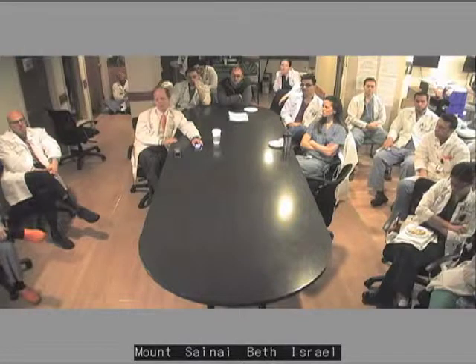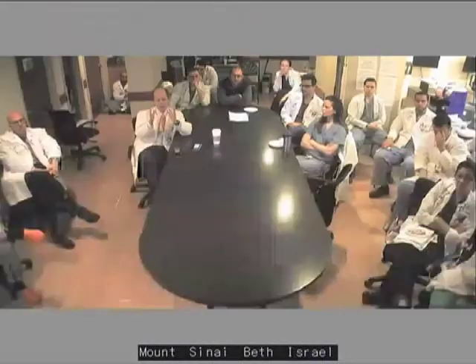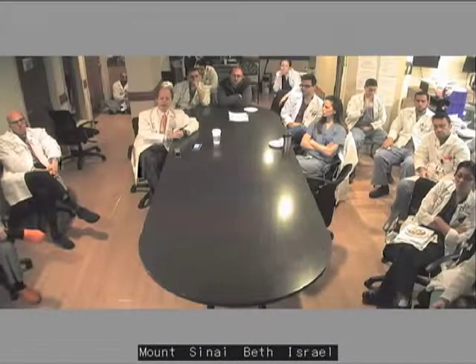I have a sort of philosophical question for you. In the field of endocrine surgery, particularly endocrine oncology surgery, we're moving more towards molecular phenotyping prior to surgery, getting information on tissue phenotyping that directly impacts decision-making before surgery as to, number one, whether or not to operate, and number two, what type of operation and what extent of operation. I have some concerns about having this massive amount of information in the operating room, how it's synthesized, how you keep your eye on the ball when you're doing an operation with all sorts of information flowing already in a very complex environment, and then you sprinkle in nursing, students, whatnot.